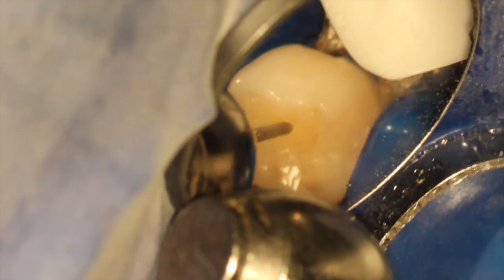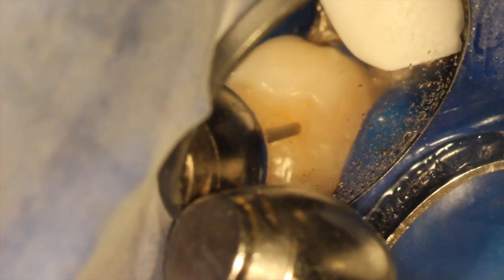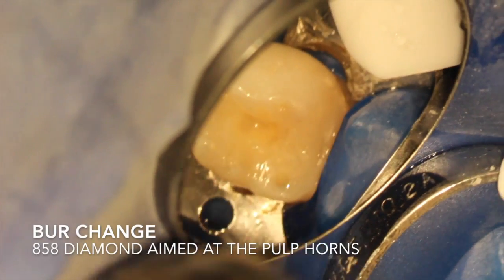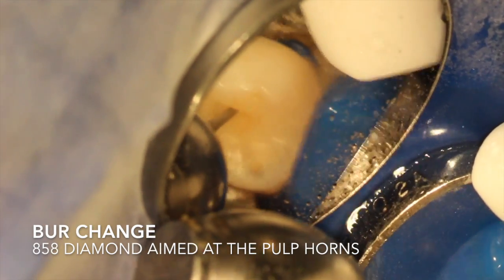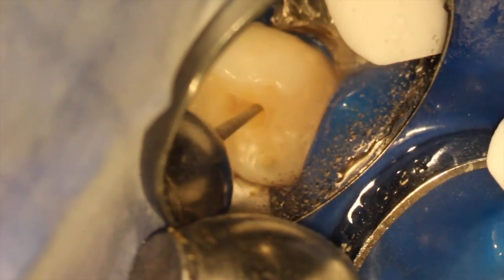As you've seen in other videos, I start with an 850 or an 858 diamond and rough out that trapezoidal access that is indicated for molars. I'm really searching for the pulp horns. You can see here I'm carefully prepping — this pulp chamber was calcified, so I'm not going to get that drop-in effect that we like. But carefully troughing, looking for color change, keeping all my landmarks intact, respecting the boundaries, and looking for that pink dot.